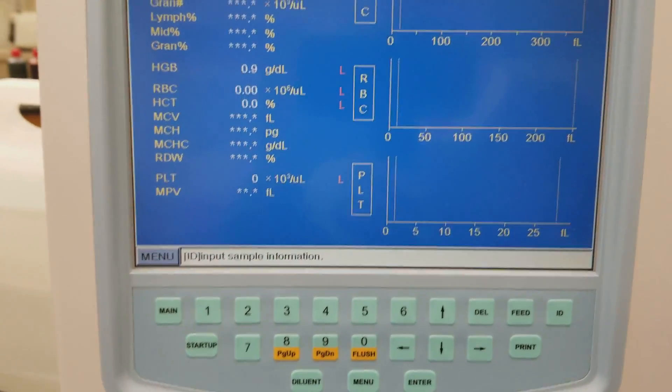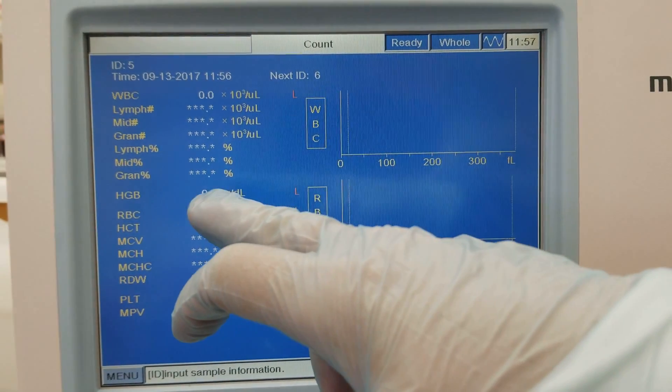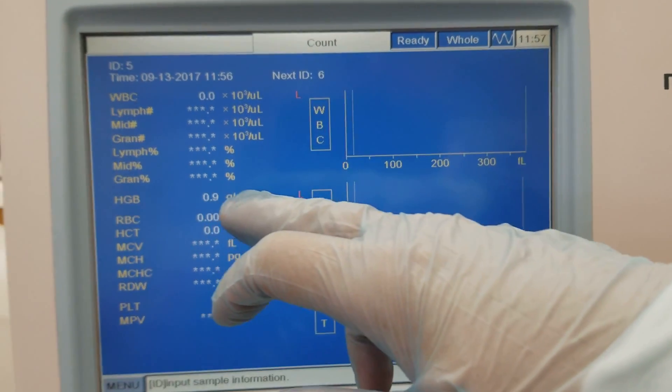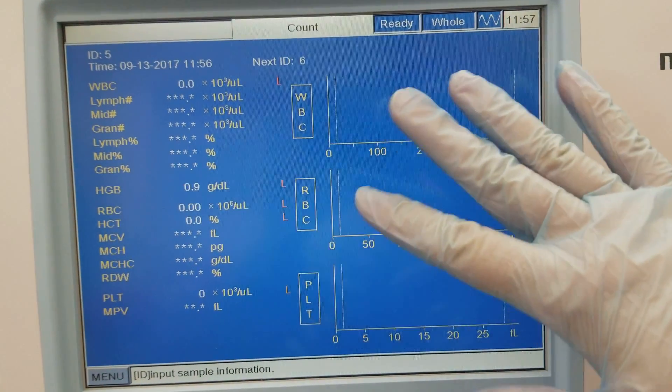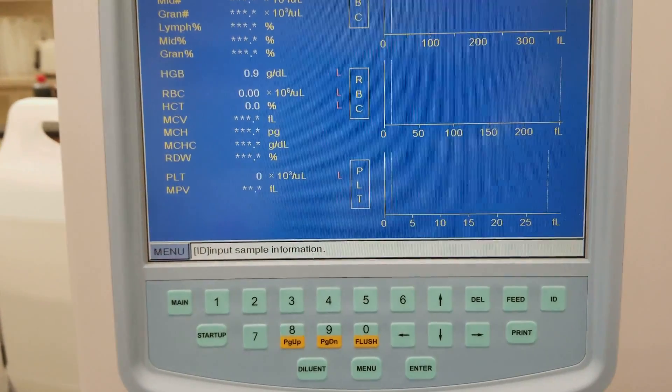I ran alcohol again and we can see that hemoglobin is hanging out somewhere. Even though we don't have anything in the histograms, we notice that it's still not actually clean.